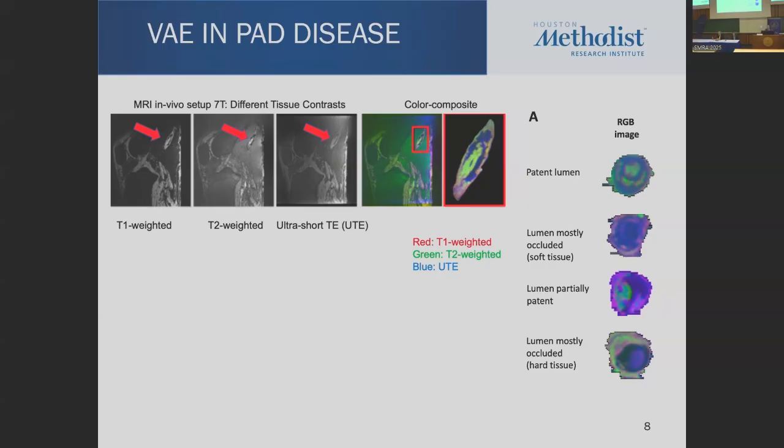her. And also an MRI. Dr. Graham Wright had some part in setting that up, and then we were charged to actually see, can this be applied here in Houston? And that's one part, how to apply it. And then, okay, how to derive some more information from those images. And this here is a little bit of a spin-off of that, using a variational autoencoder, or artificial intelligence.